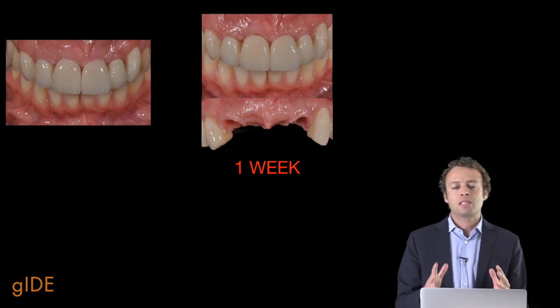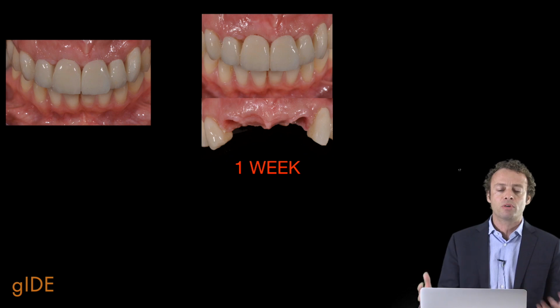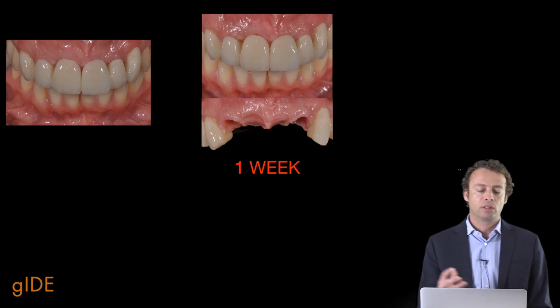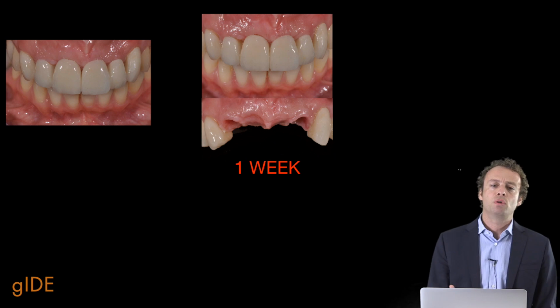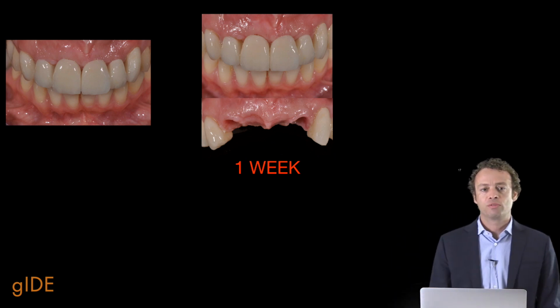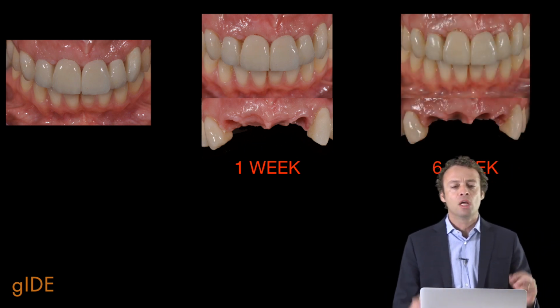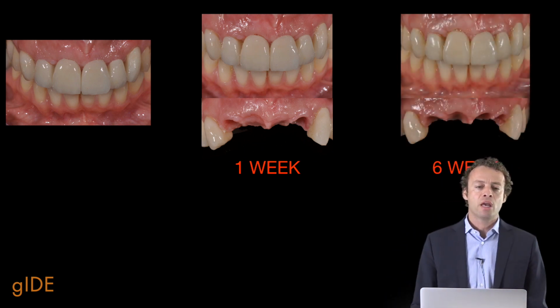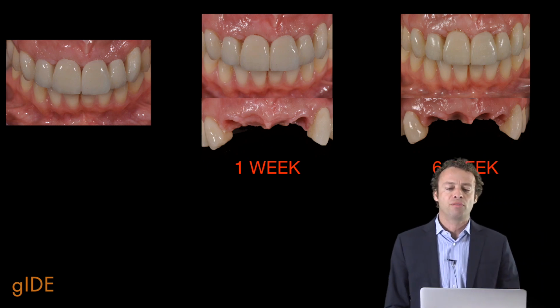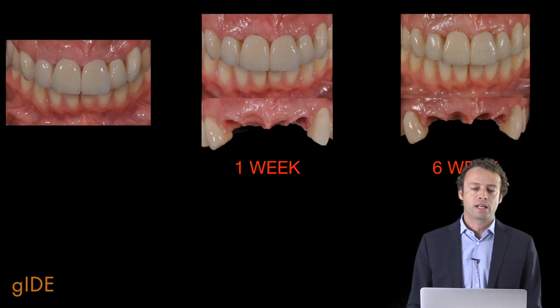and it's important simply to add composite without using any kind of drill or burrs, because if you use drill or burrs, you cut away the bone and the soft tissues, while if you use composite, we push the soft tissues, we move the soft tissues and the volume. So step by step we are able to redesign everything, to recreate a sort of pseudo-papilla. And this is exactly what we have to do. This is exactly the role of the prosthodontist in these clinical situations.